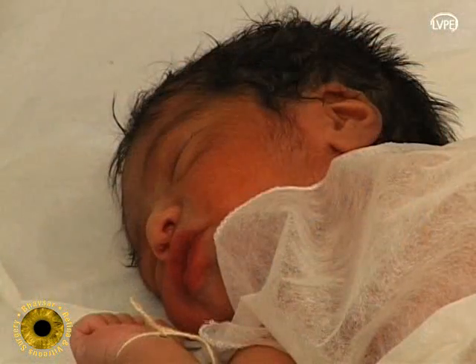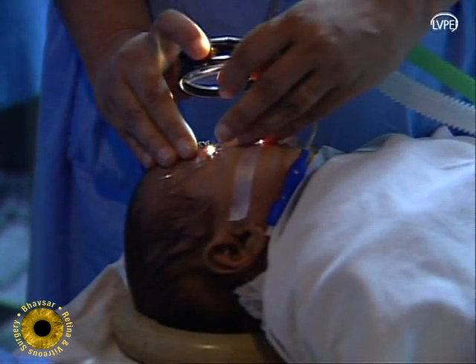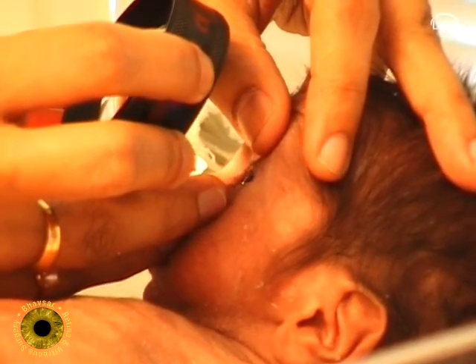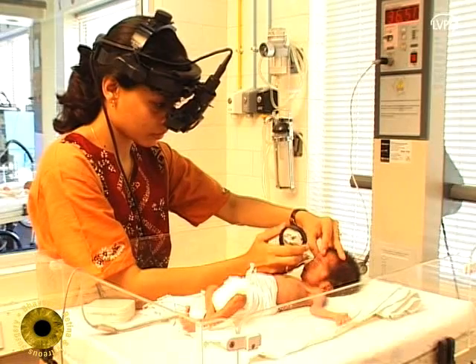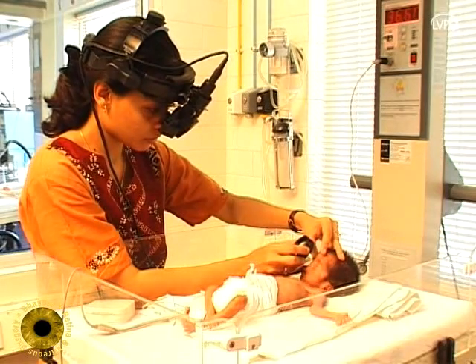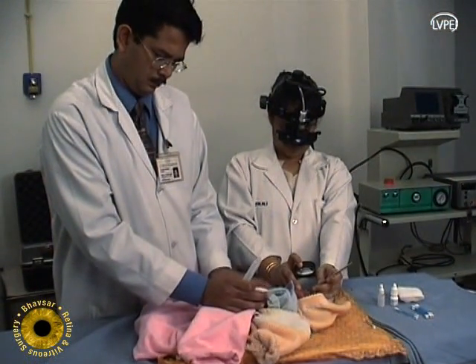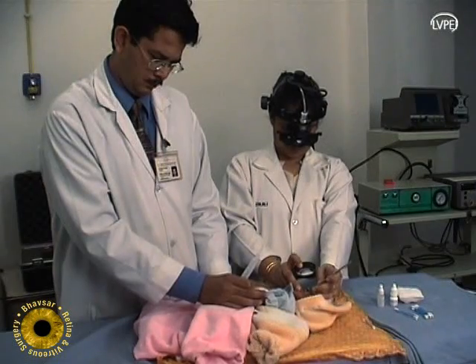For higher weight babies, general anesthesia would be needed in most cases. The laser surgeon should be experienced in adult laser therapy before embarking on ROP laser. The assistant and the surgeon are able to stabilize the small head and chin while doing the laser.